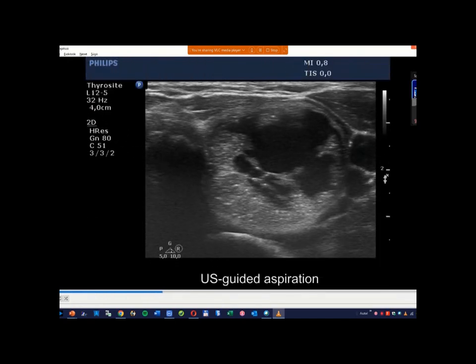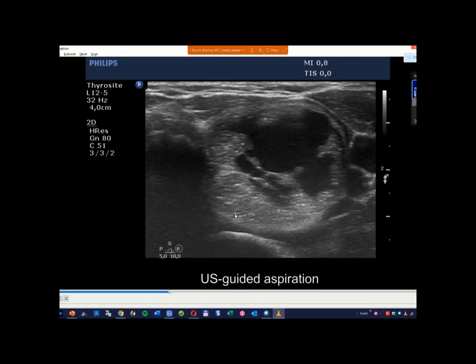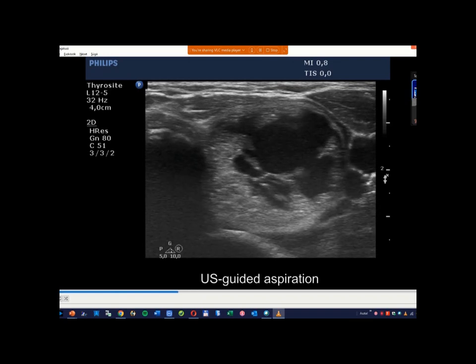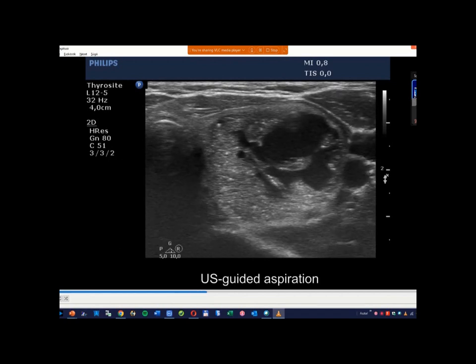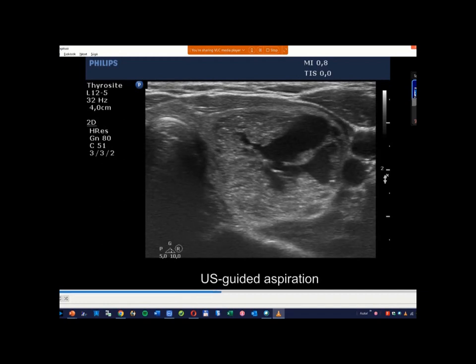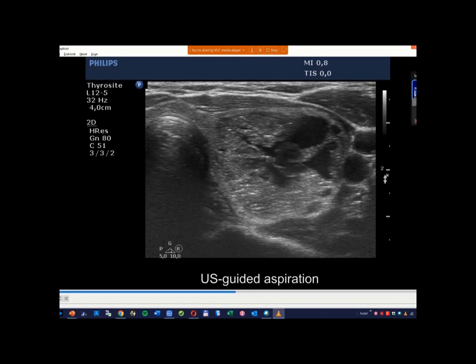I remind you that the diagnosis of microcalcification is a matter of exclusion. If you see, there are many lines. So I can accept if someone has doubts, and even I have doubt whether all of these figures are not microcalcifications. But it would be very bad if we state that this nodule has obvious forms of microcalcifications. So these can be suspicious, agreed, but these are not those forms.